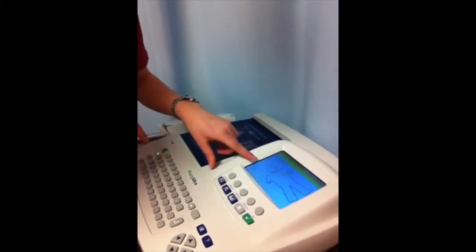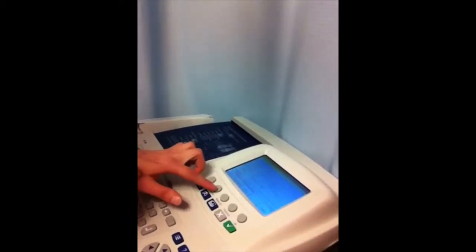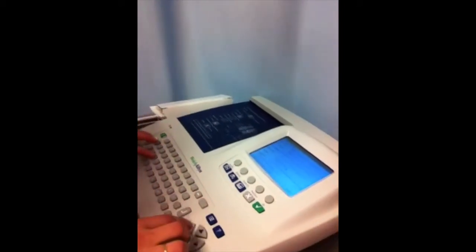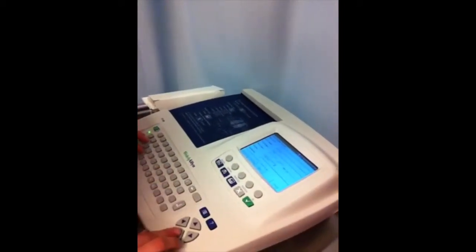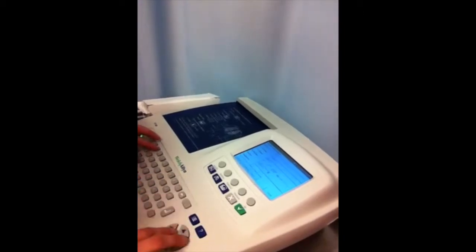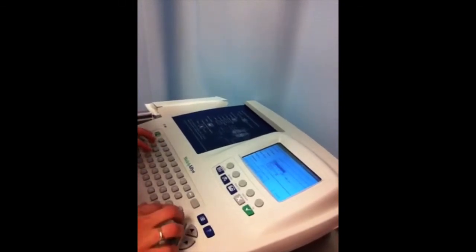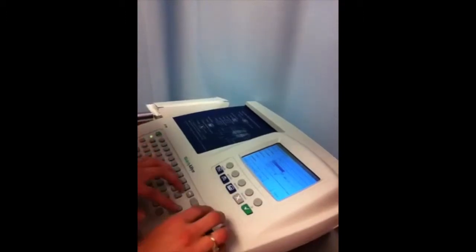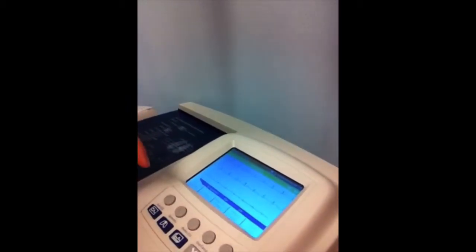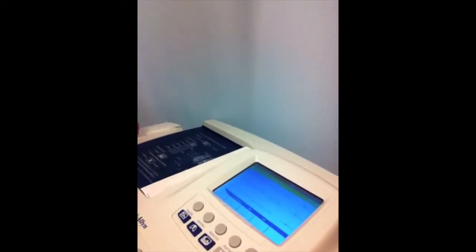All these green dots indicate that the electrodes are placed in the correct areas, so then you want to hit auto EKG and enter the patient's information, and hit done when you're finished. Where it says print EKG, you want to press that. The patient needs to sit still for 10 seconds as it analyzes the data, and here we have it printing.